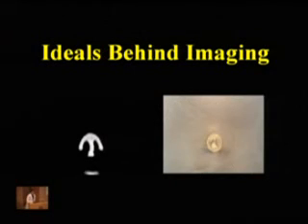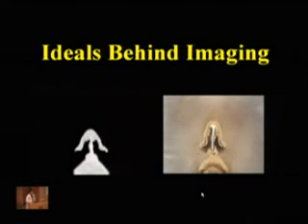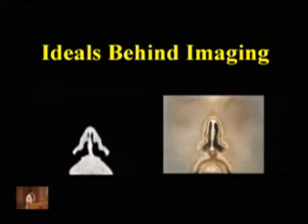And finally, there is an ideal that we should all have when we look at the CT scan of the patient, which is that when we look at the CT scan in a systematic manner, we should be able to reconstruct what is going on inside the real patient, as illustrated by this one, which is an animation from CT scan and endoscopic finding on the same cadaver. But certainly this should be the ideal behind our minds when we look at the CT scan again and again.